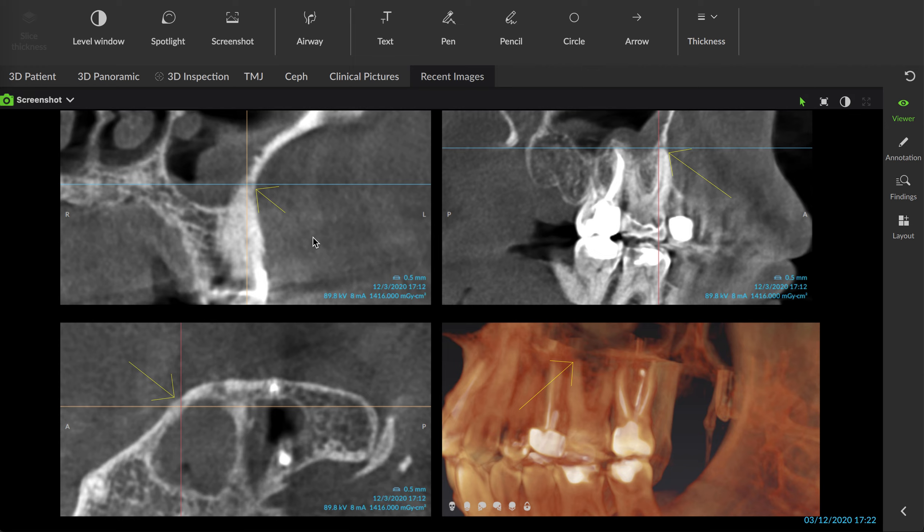Another case for you. This is a patient from last night. He presented at about 5 p.m. with really intense pain on his upper left.